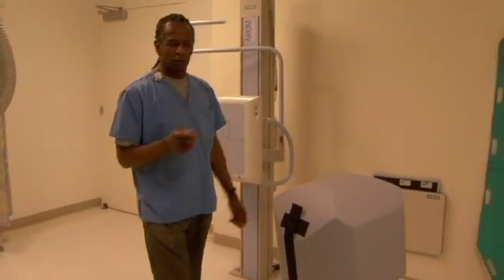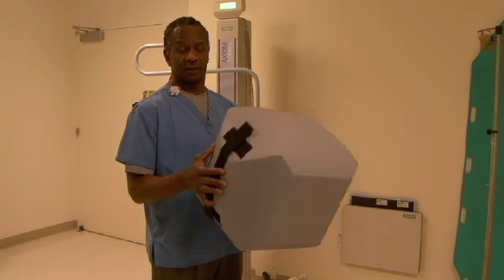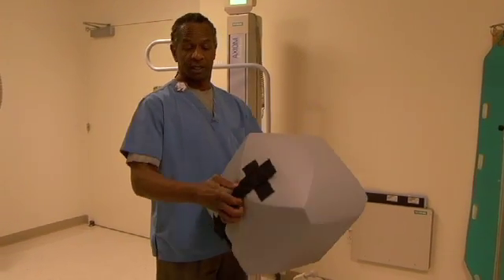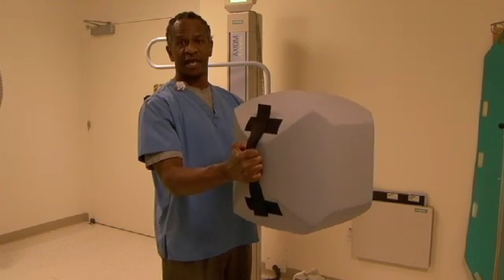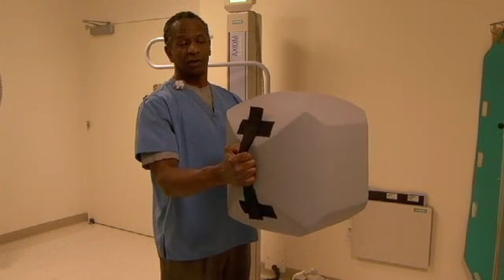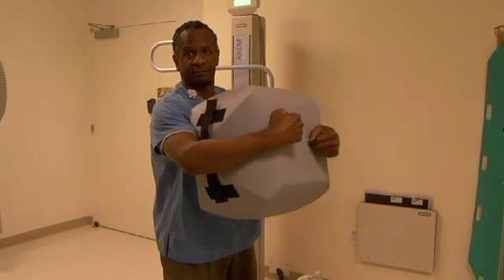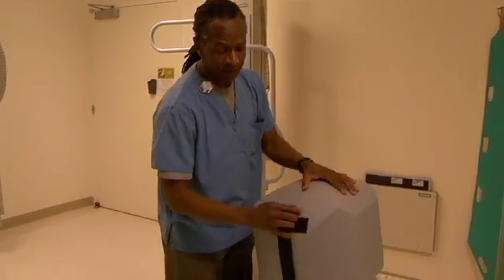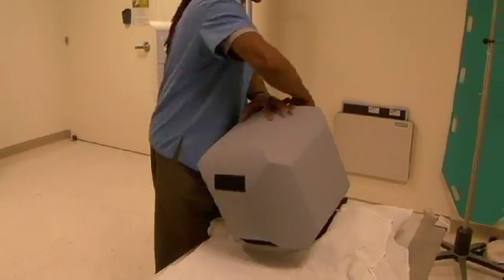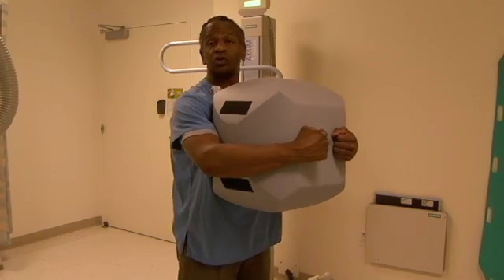I want to stress one point about this ball. When a child sees it, the first thing they go to are the straps, treating them as handles — but they have no use as handles. The ball is meant to be put into the chest and hugged. So once you get the ball, take the straps off, store them somewhere nearby, and just hug the ball. That's what it's used for.